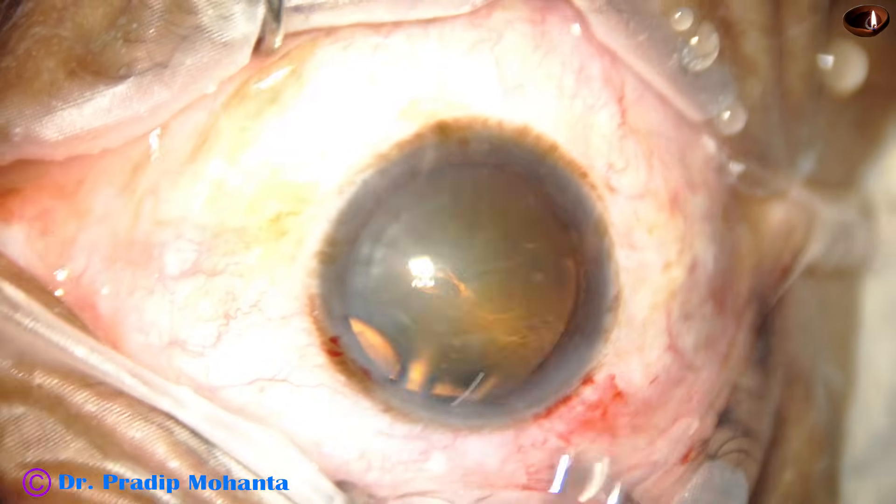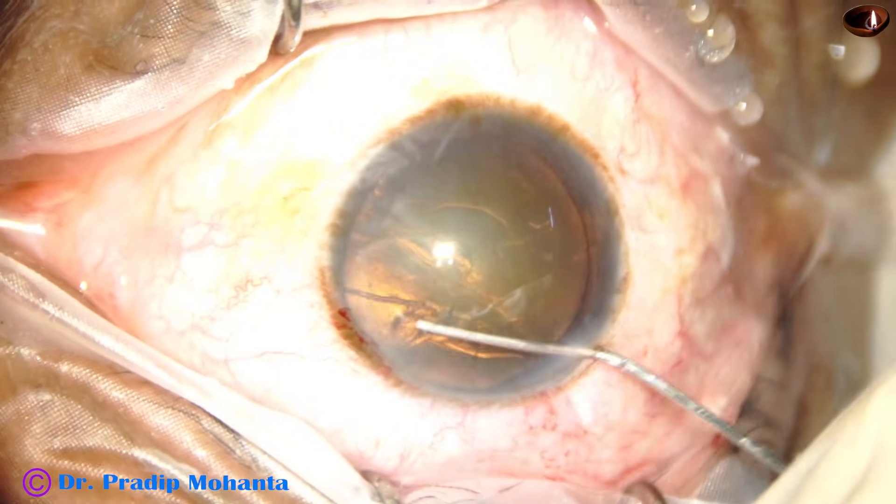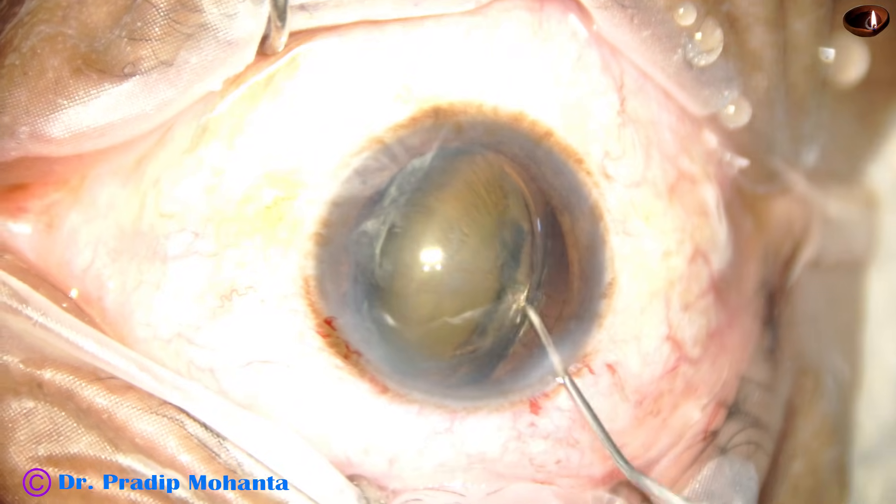The size of this rhexis is about 5.5 to 5.75 millimeters. The rhexis should be on the larger side but less than 6 millimeters if you want to use this technique.